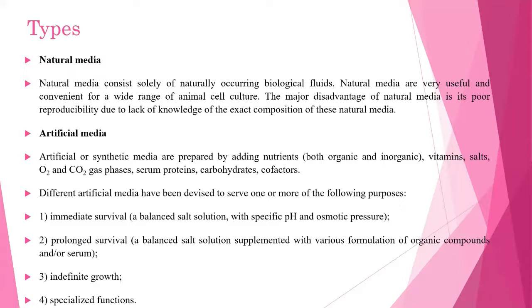Artificial media, yes, we know its composition, and we know how to prepare it by ourselves. So artificial or synthetic media are prepared by adding nutrients. Both organic and inorganic nutrients are used, and other things which are added are vitamins and salts. It's enriched with oxygen and carbon dioxide, and then serum proteins, carbohydrates, cofactors. All these things are added to the artificial or synthetic media.